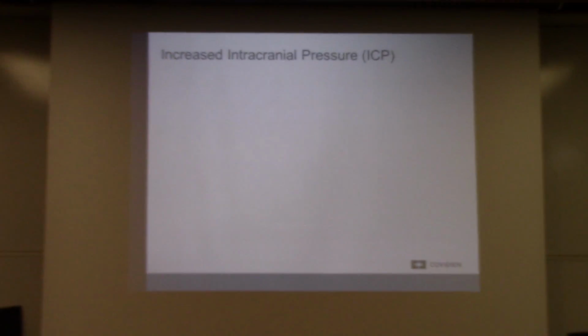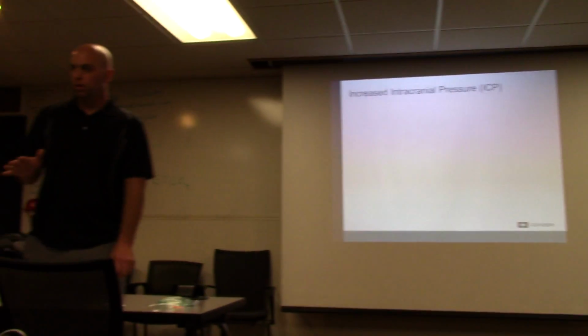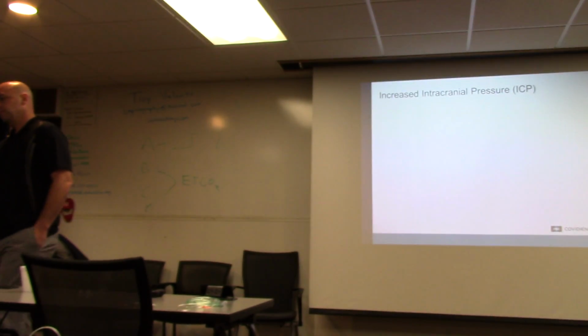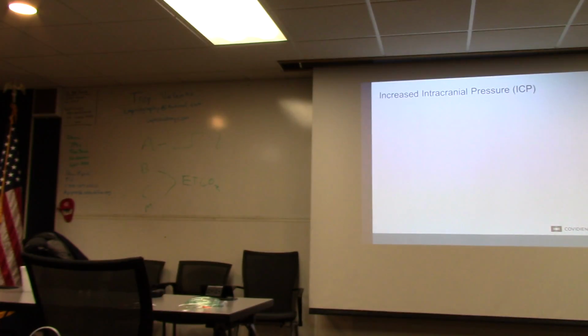In cardiac arrest, how do we ventilate a patient? How many times a minute? 10. How much volume? Third to half the bag.